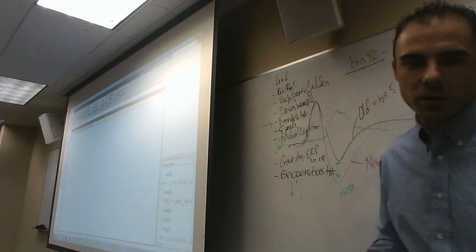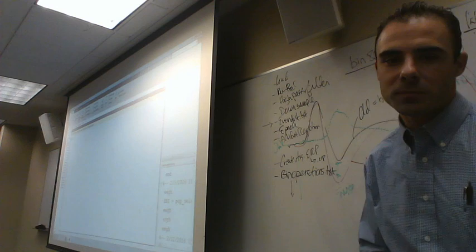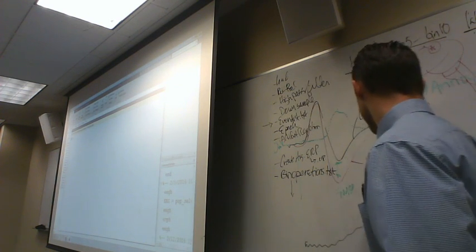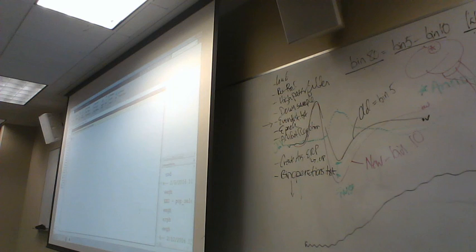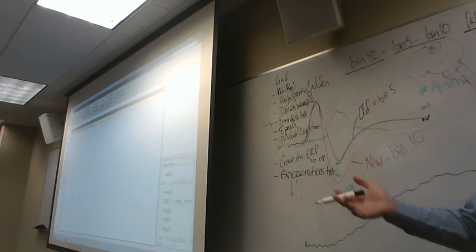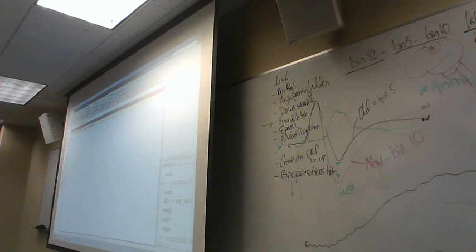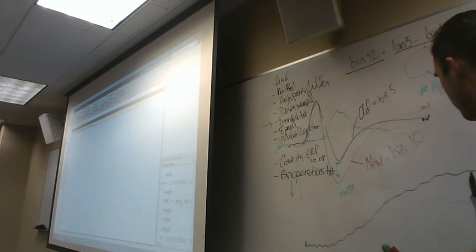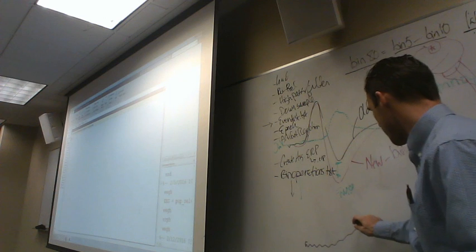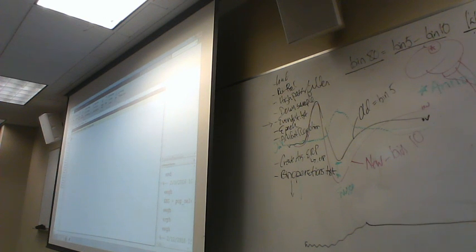The next one, we talked about this a lot before. Let's say you had this. What would that be? Yes, skin potential, drift, a handful of different things could qualify for that. What if, instead, it came across here and started rising and just looked like a plateau?